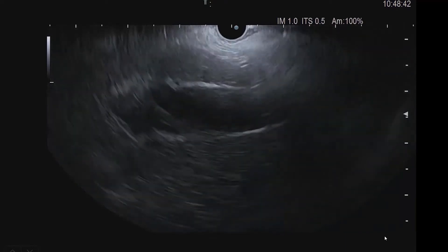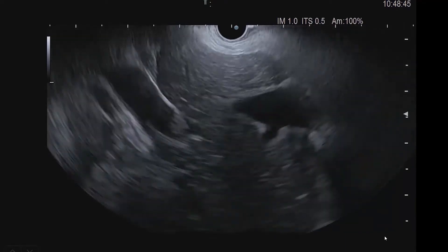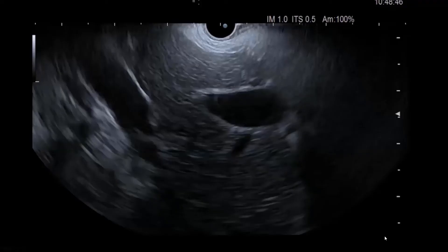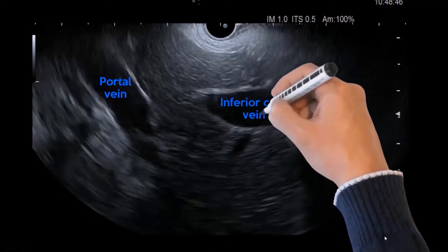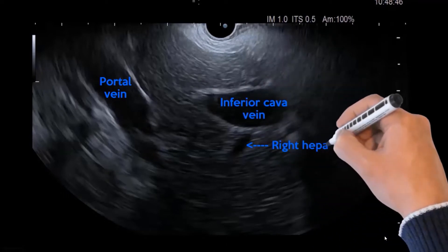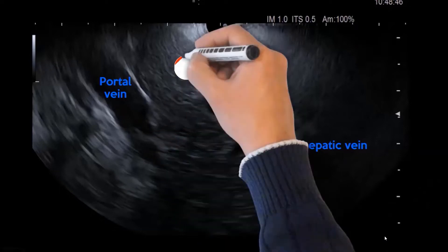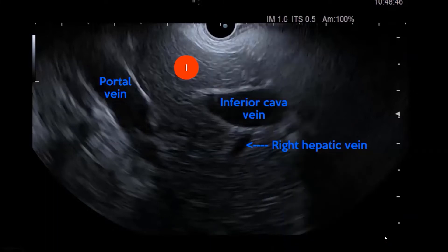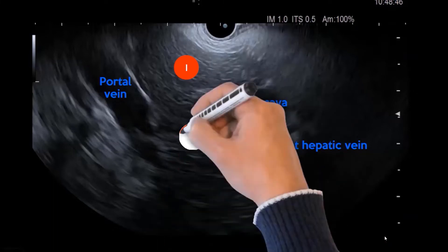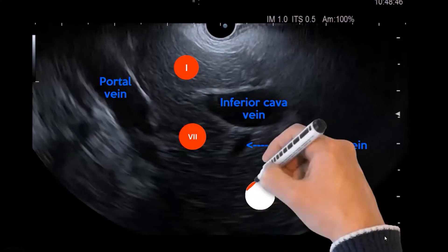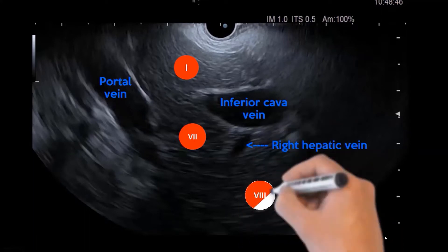First, it is important to identify the main liver landmarks. These are the portal vein, the inferior vena cava, and the right hepatic vein. These structures are very important to identify different liver segments — in this case, segment 1, segment 7, and segment 8 below the right hepatic vein.